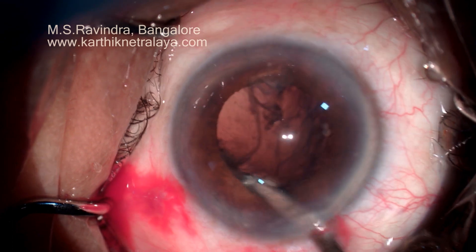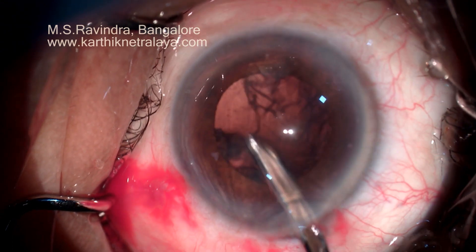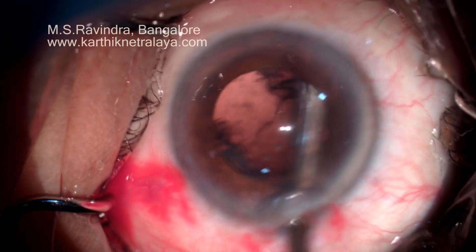This enables complete closure of the tunnel soon after surgery without any fish-mouthing. The cortex is easily aspirated now because of hydrodissection, facilitating removal by separation from the capsular bag.